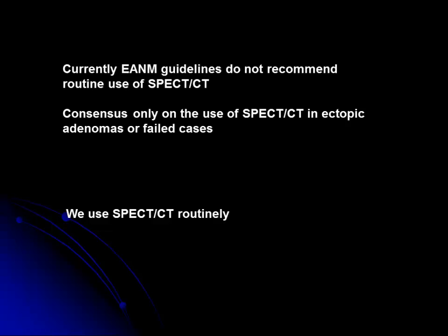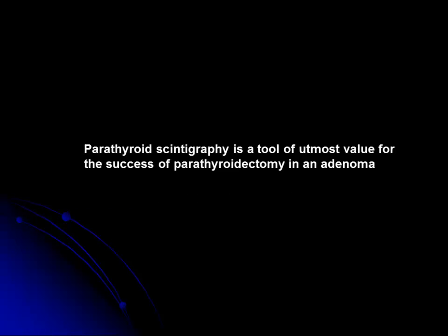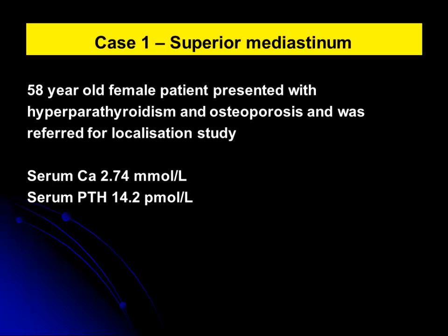We routinely use SPECT CT as our normal practice. A negative MIBI scan is a predictor of patients who are less likely to be cured. Parathyroid scintigraphy is a tool of utmost value for the success of parathyroidectomy in an adenoma.